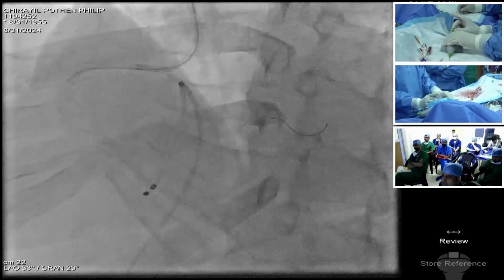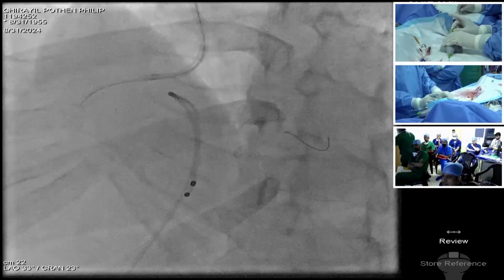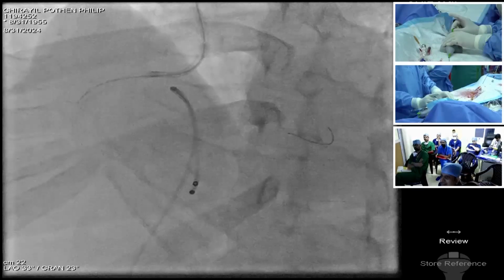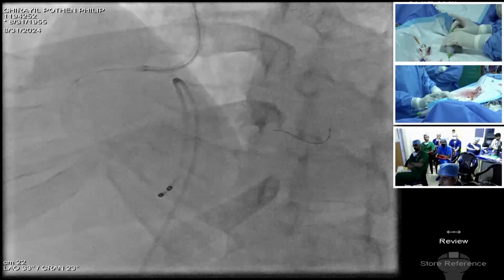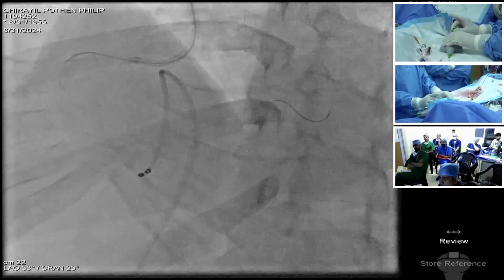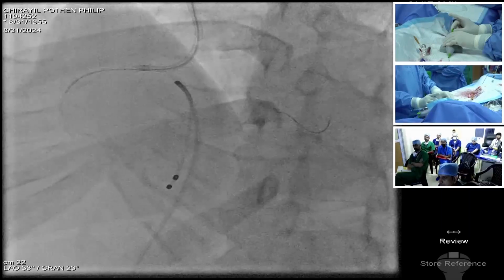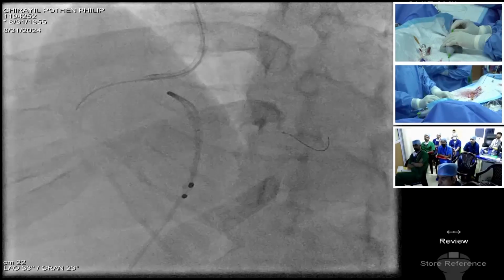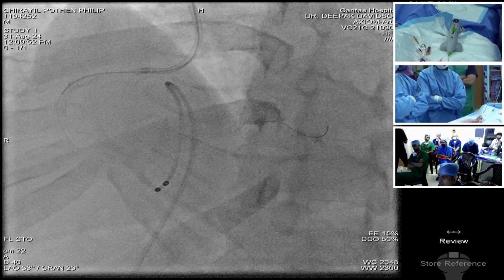Now while doing rota, we have a habit, even though you can do it for 25 or 30 seconds, we always make sure that we stop at 15 seconds and wait meticulously for 1 minute before we do the next run with rota. But with this, probably even 25 seconds wouldn't really produce much slow flow, things like that. So only when we hear this sound, we stop and wait for 25 seconds at least.